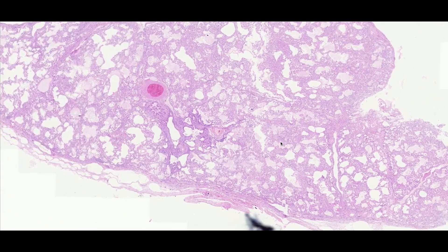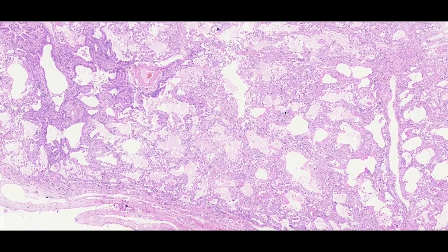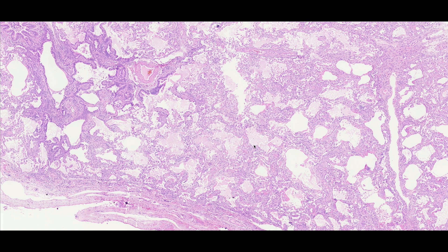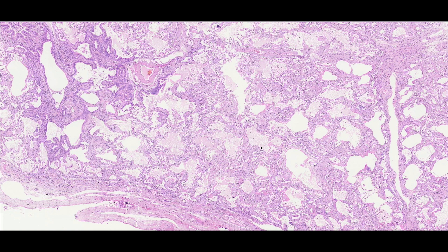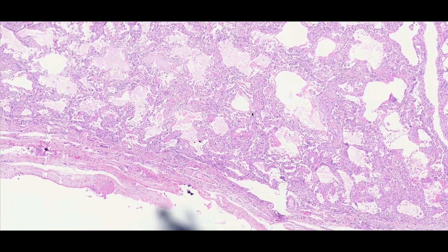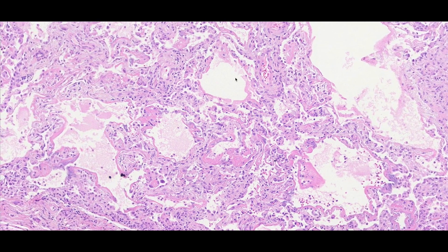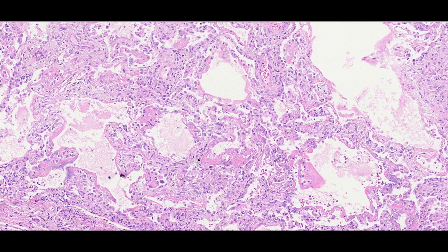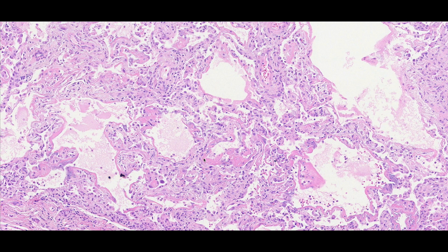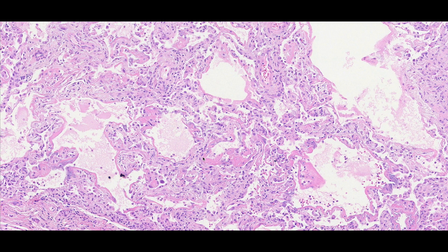Let's zoom in a little bit higher and start to see what's going on. At intermediate magnification, notice that it's a relatively busy process — there's a lot going on. Before we get into looking at all the components, it's helpful to take a step back and think about the underlying cause and mechanism behind this diffuse alveolar damage.